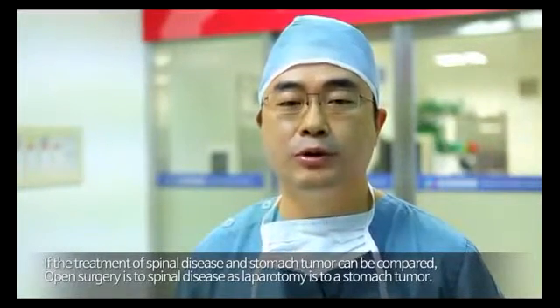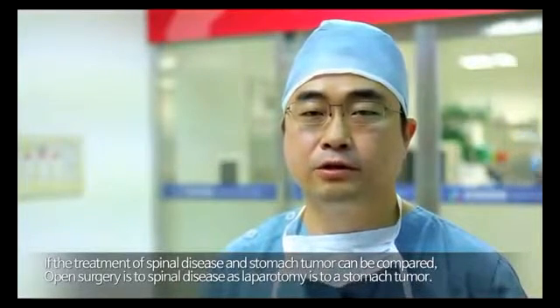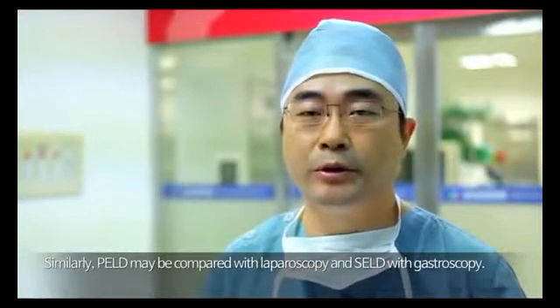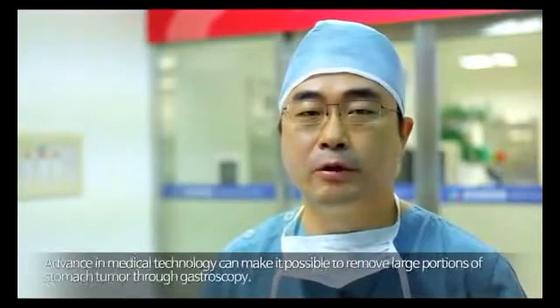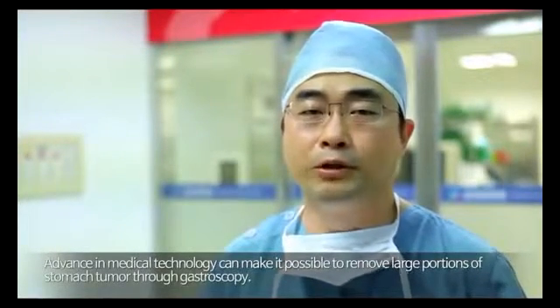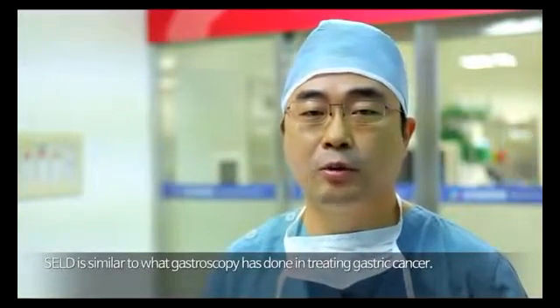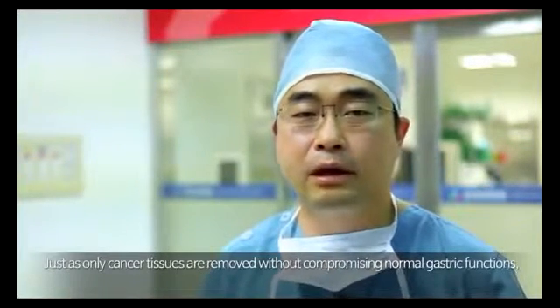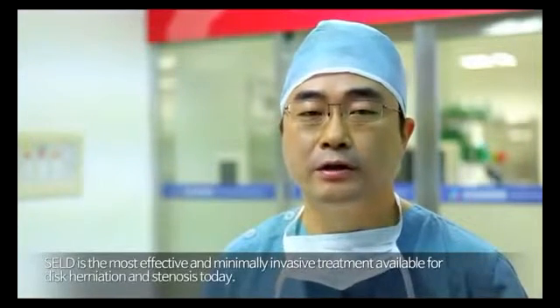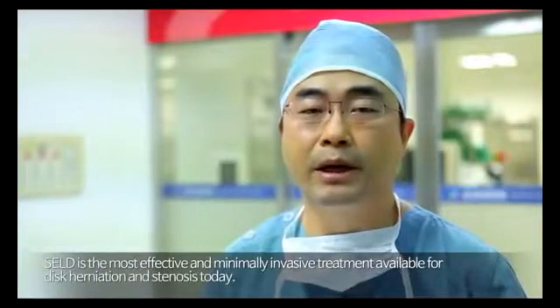If the treatment of spinal disease and stomach tumor can be compared, open surgery is to spinal disease as laparotomy is to a stomach tumor. Similarly, PELD may be compared with laparoscopy and SELD with gastroscopy. Advances in medical technology can make it possible to remove large portions of stomach tumor through gastroscopy. SELD is similar to what gastroscopy has done in treating gastric cancer. Just as only cancer tissues are removed without compromising normal gastric functions, SELD is the most effective and minimally invasive treatment available for disc herniation and stenosis today.